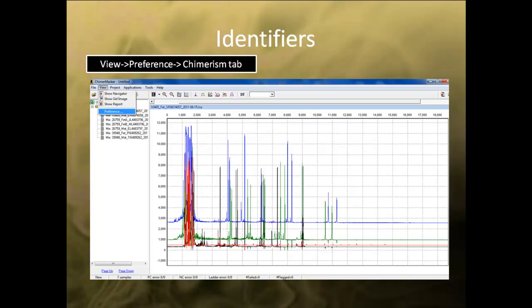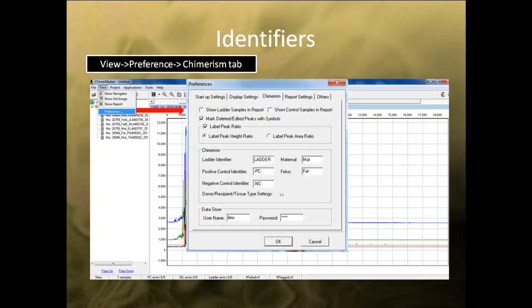In my example dataset, I have three separate patients identified by their patient IDs. The files are separated into maternal and fetus sample with the appropriate identifier in the file name.